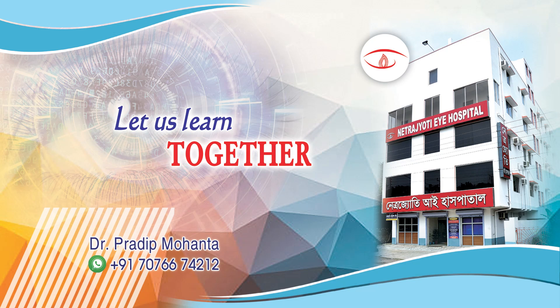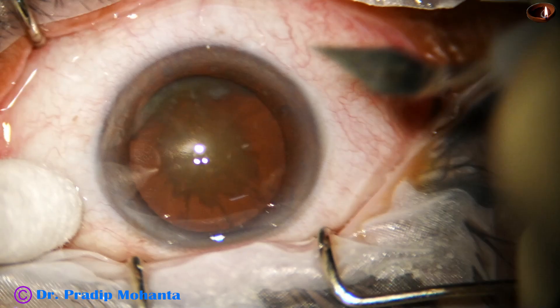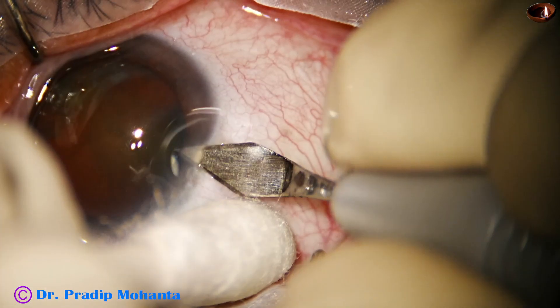In this video, we will see how we can use Mohanta's pre-chopper in a hard cataract. This is a posterior subcapsular cataract with grade 4 nuclear sclerosis. Let us see the minimally edited surgery.